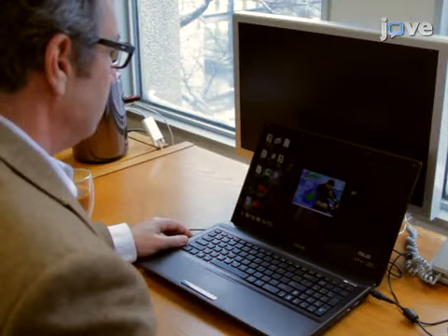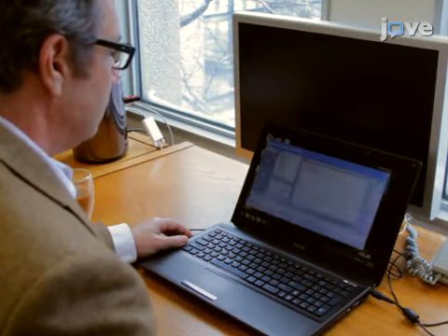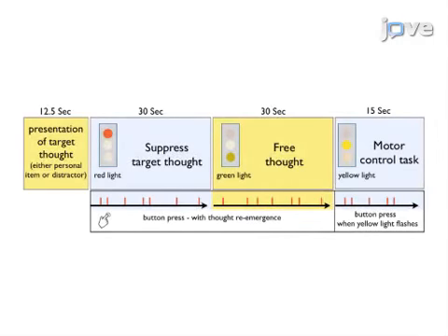For this protocol, start by building a modifiable thought suppression paradigm that will be viewed by participants inside the MRI scanner. E' can be used to program the text and image slides and assure that button press responses are collected with millisecond timing. The paradigm should consist of 4 blocks, each marked by a newly presented screen.